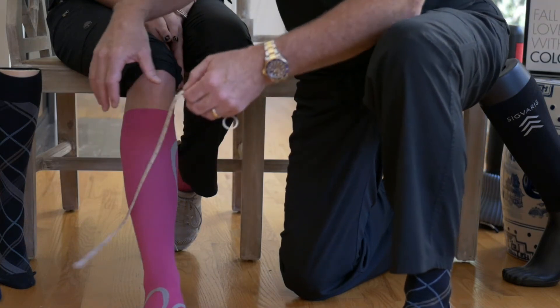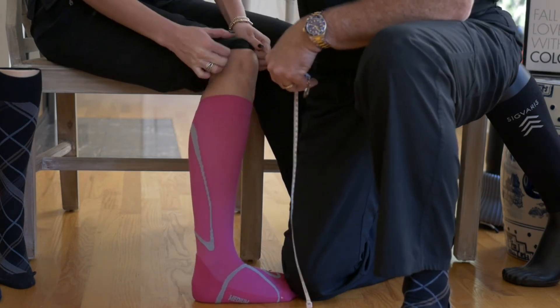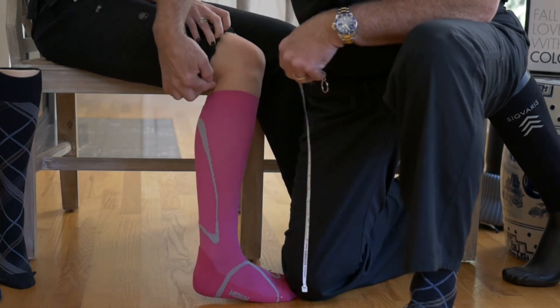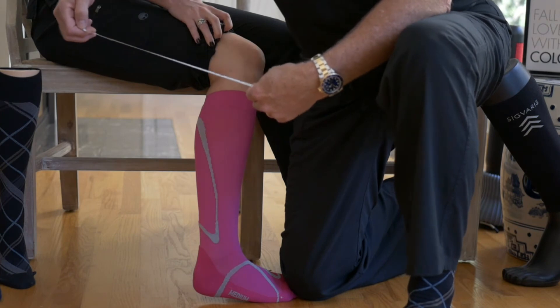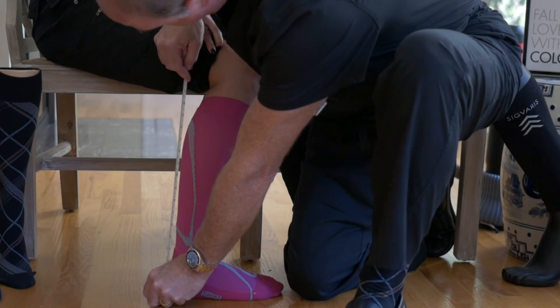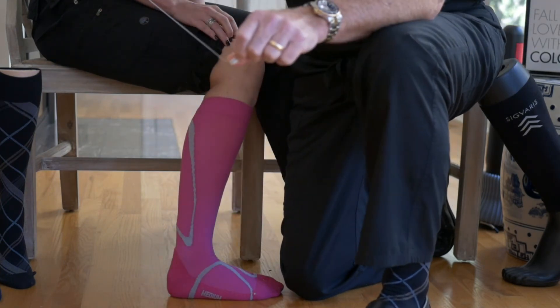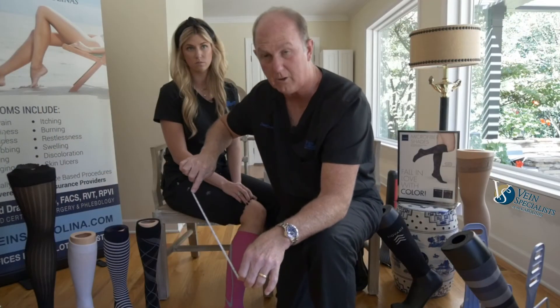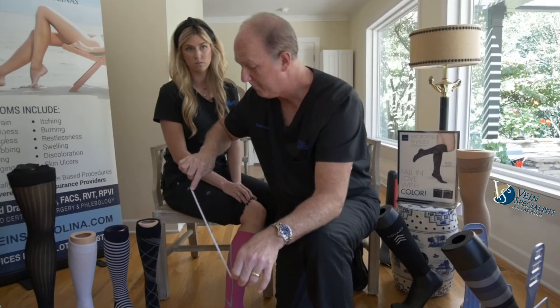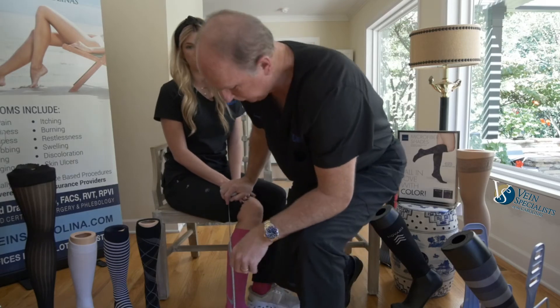The next thing is the length. You want to measure to the crease behind the knee, with the foot flat on the floor, and measure to that crease. If the crease is more than 16 inches — Kendall has long legs, hers is 18 — then you would wear a long. If it's less than 16 inches, you would wear a short. That's how you measure for the calf-height garment.